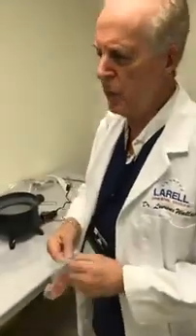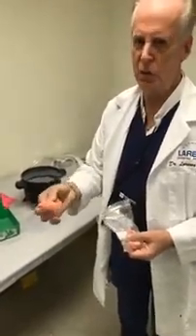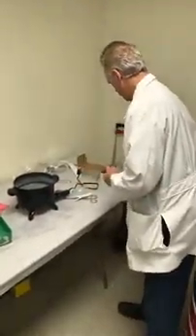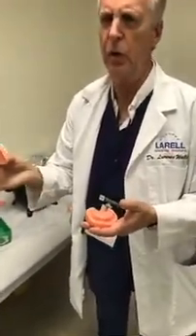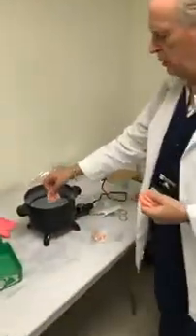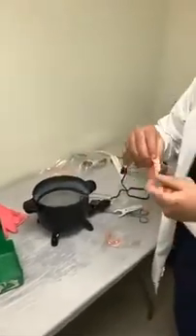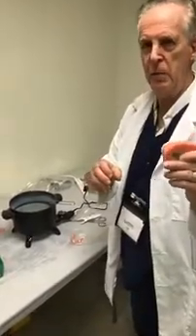So the next step in the process after we have the model is to find the denture template that is the closest fit to the patient. We measured over 3,000 models to come up with the 5 different sizes that we have. These templates are thermoplastic acrylic with individually set denture teeth. Once it's trimmed, it's placed into boiling water for about 45 seconds. That makes it soft around the sides, and we're then able to closely mold it to the model. Now we're ready to take it to the mouth for a custom reline.